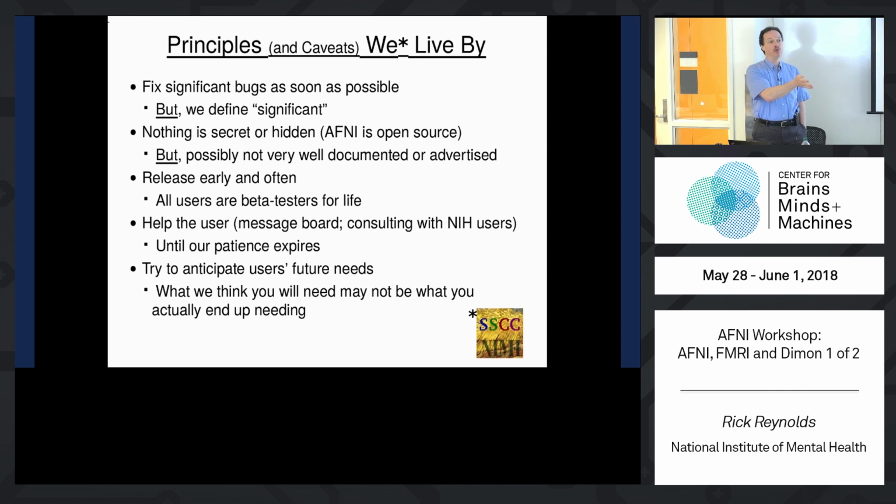That means after 2 or 3 years, you're using 2 or 3-year-old software. Hopefully in that interim, improvements will be made and you're not using them. So there's a trade-off. If you just stick with one version, you don't get the enhancements.